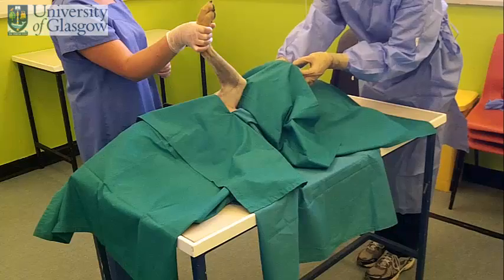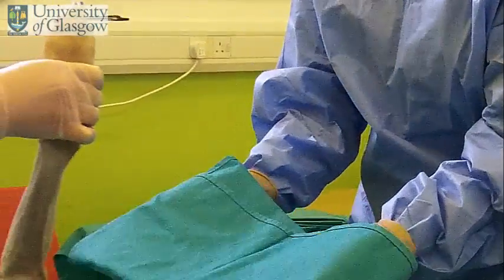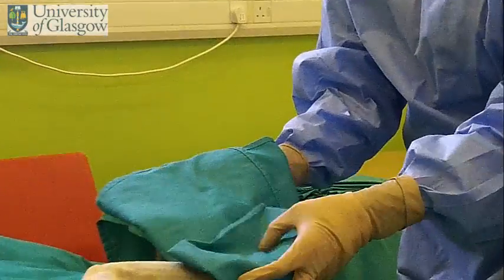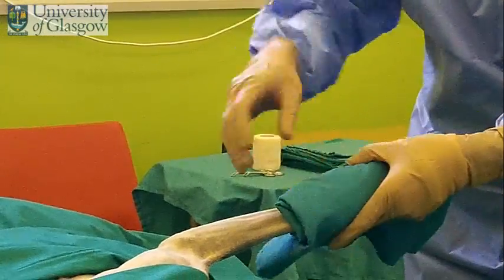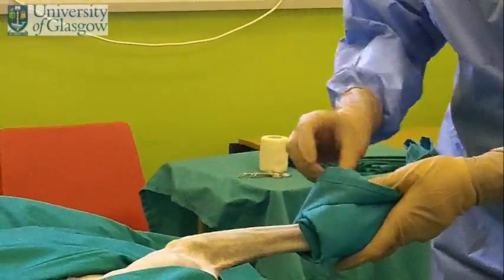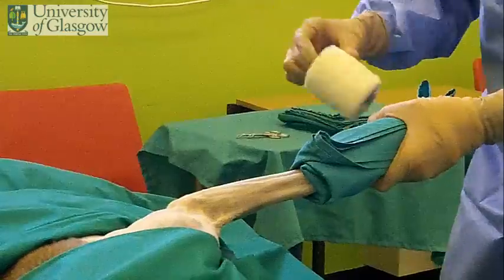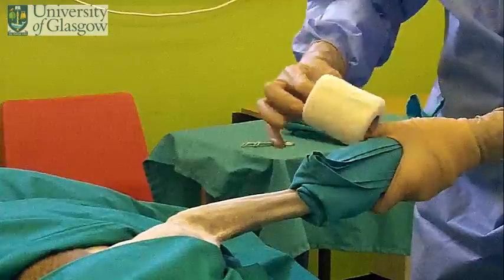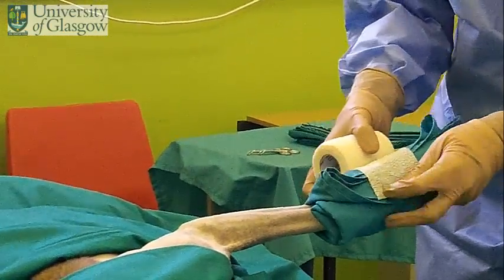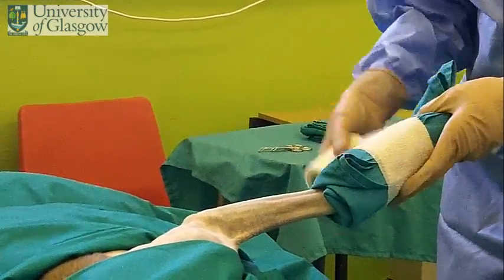Place your towel now. Now you're going to have a small sterile towel. You'll ask the assistant to place the limb in the towel. You're going to wrap the limb in the towel so it's protected. You'll generally wrap some sort of bandage so the towel stays on the limb, and this bandage will always be sterile. This is just so the limb can be handled and manipulated by a surgeon.